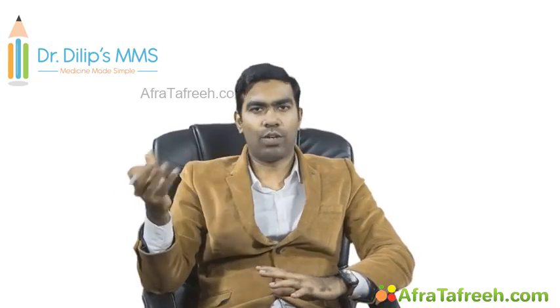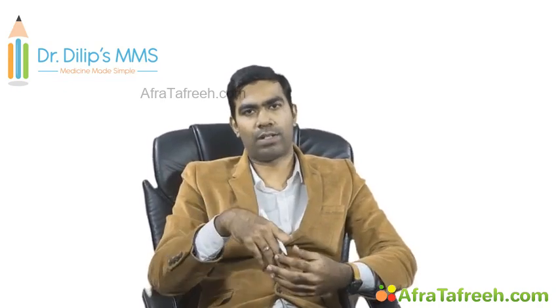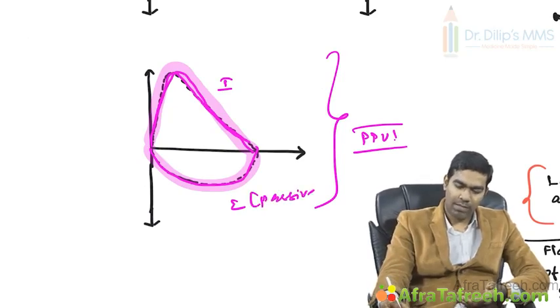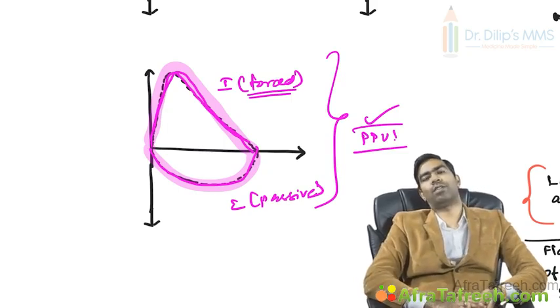Physiologically, when you are doing a flow volume loop in the laboratory in a patient who is not ventilated and is breathing on their own, you have a forced expiration and a forced inspiration. The forced expiration forms the upper part of the curve. But in a ventilated patient who is intubated and given positive pressure support, it is not forced expiration. It is a forced inspiration and a passive expiration. Whenever you see a reversed curve like this, please tell that the patient is getting PPV, positive pressure ventilation, or mechanical ventilation.